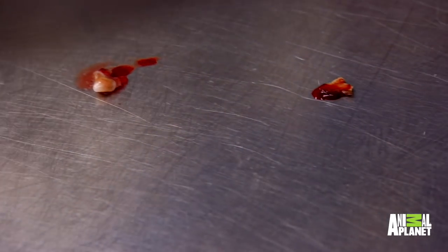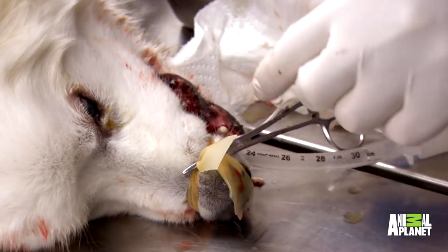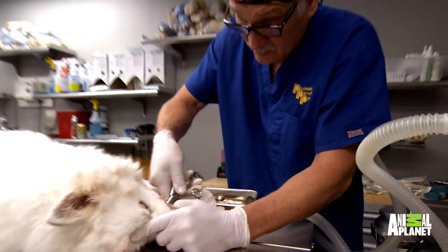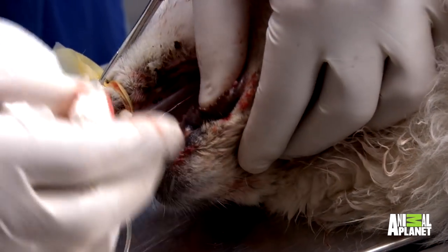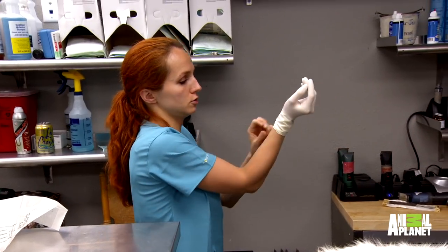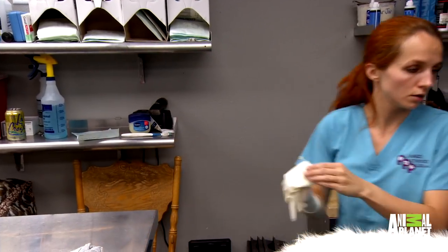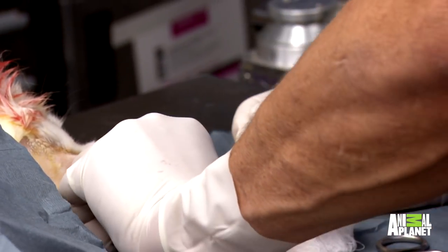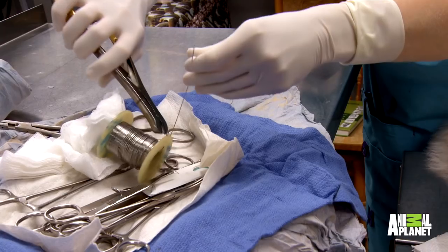The bone will actually just dissolve around the root, so you get really thin bone there. I think it's going to be a real problem getting it to heal because the bone density is really thin. Petra can get her fingers in there where I can't — if I get my fingers in there I'm taking up the whole space. I think we can get three wires on that.